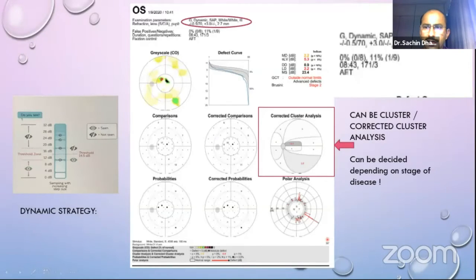Yeah. And here you get all the dimensions like the pupillary diameter, the false positives, false negatives, testing time, and the type of fixation monitoring that is used. So all the information that you see in the Humphrey above is given here in a similar fashion, including the pupillary diameter, and the only additional thing is the automated eye tracking, which is slightly different.